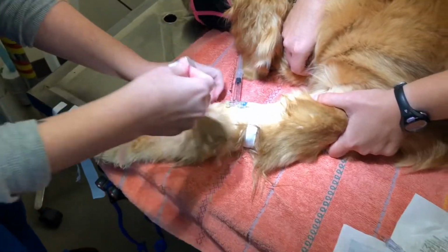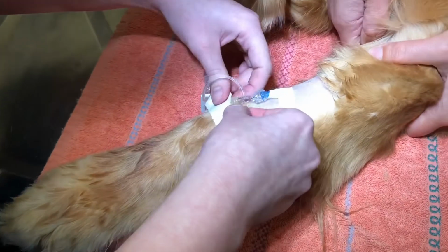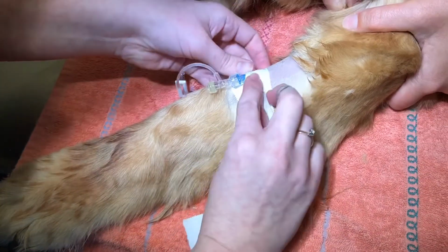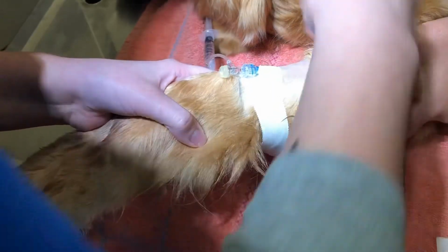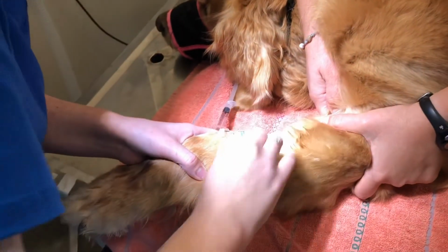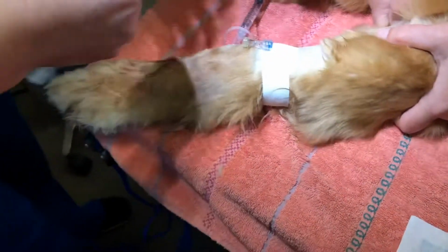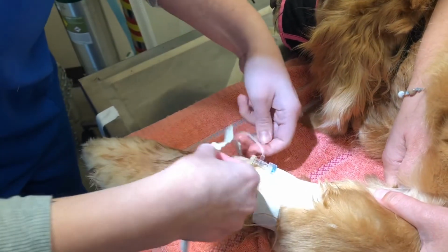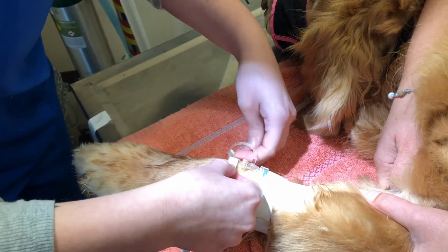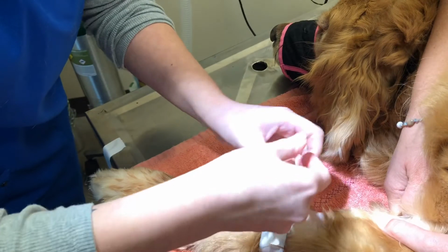The next piece of tape is a bigger piece, but it has a notch in the middle, so we'll slide that underneath. Our third piece of tape is another skinny piece, but we're going to make a notch in the middle so that it can wrap around like this.